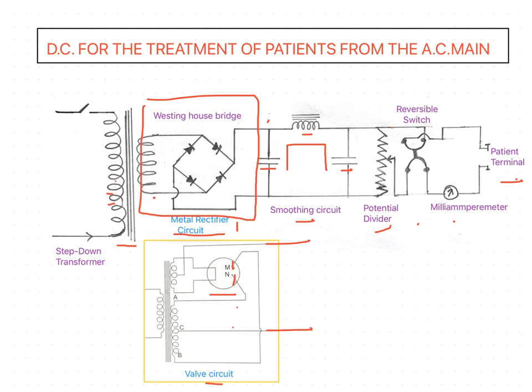And in this session I want to mention some of the steps to be taken for the care of apparatus. How should you care for the physiotherapy apparatus? I want to discuss it here. All apparatus should be clean and dry, dusted regularly and covered when not in use. Some moisture present on the apparatus is liable to cause corrosion, and if any part of the circuit is affected, extensive damage may result.